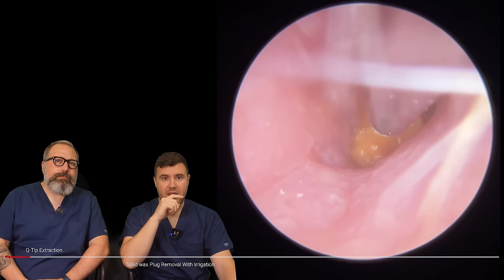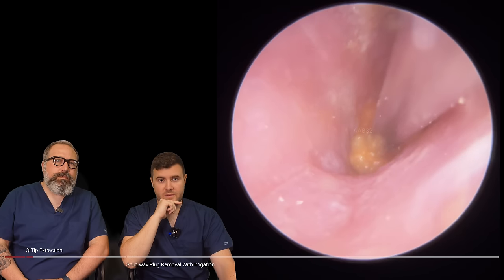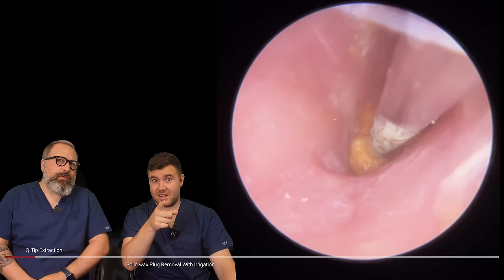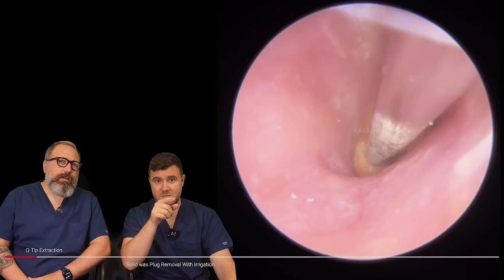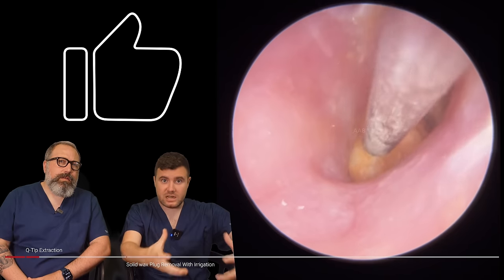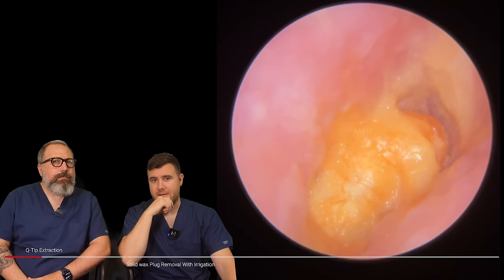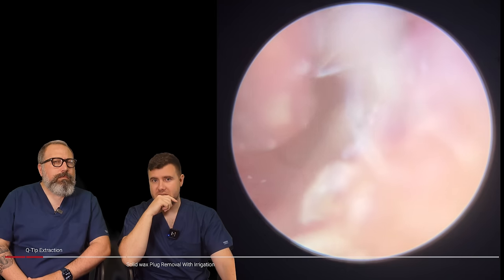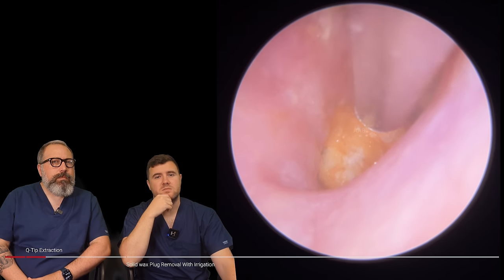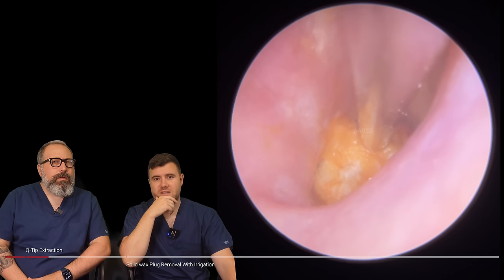So we're going to attack this deeper, much, much deeper section here, very, very slowly. It almost looks like there's a lot of irritation to the canal wall as well. Now as I'm slightly moving this little piece here, it's just releasing moisture that's held behind this. It wasn't actually going anywhere — I was moving it slightly but I couldn't get a suction grip, which I thought — hmm, that's different. That's not right. And you'll see why in a second.